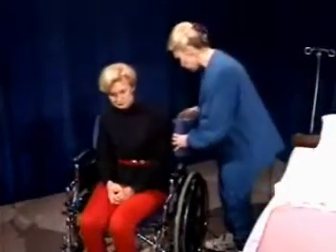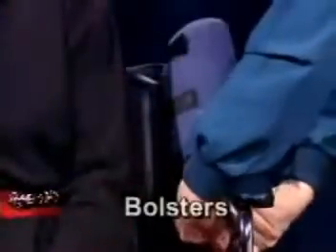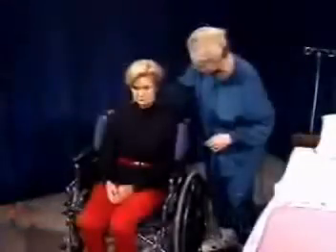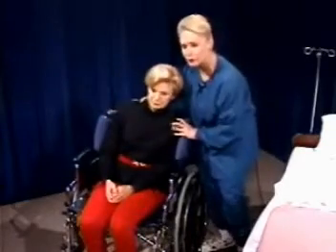This is called a lateral support bolster. When it's closed, it makes a round formation with the Velcro, like a bolster would be, and it's used on a patient that has decreased trunk control. That is, they tend to lean one side or another. It's fashioned around the wheelchair with the Velcro straps. I have the other one on our helper today already, and it shows that it holds the patient firmly in place. So if they tend to lean one way or another, it'll give them that extra support required.